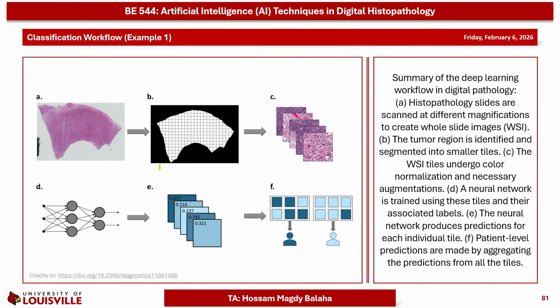Having defined these tasks, let us now examine how they fit into a real-world deep learning pipeline. The first workflow illustrates a tile-based classification approach, which is one of the most common strategies due to the gigapixel size of the whole slide images. The process begins with scanning histopathology slides at high resolution, let's say 100x or 400x.